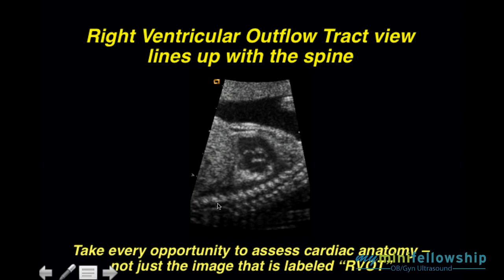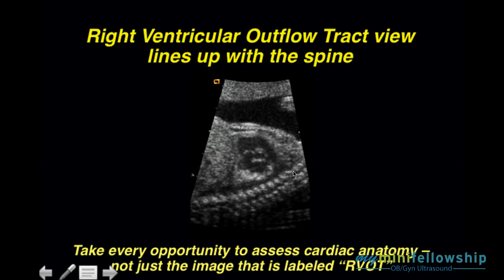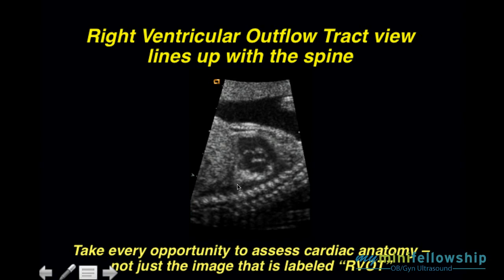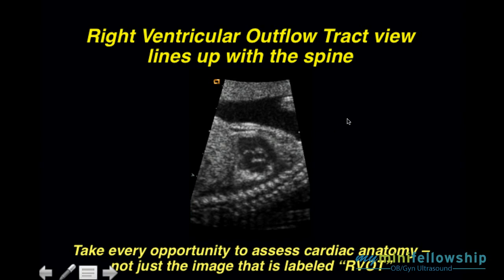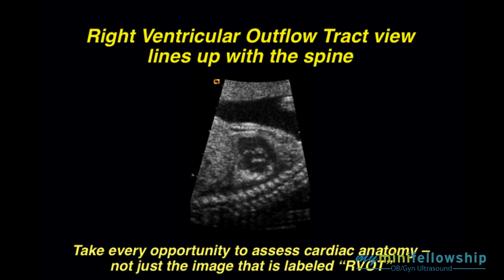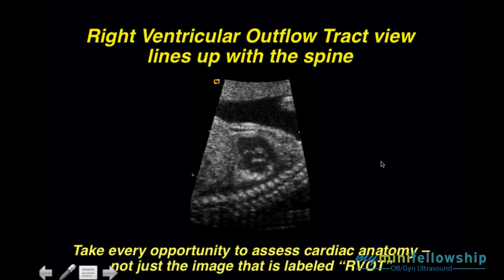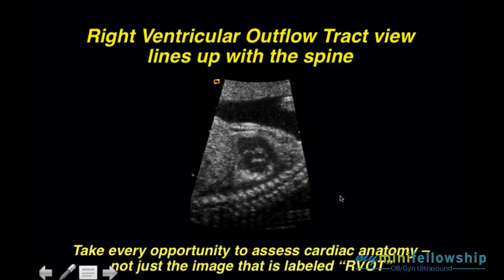Here, the sonographer is trying to get a longitudinal view of the thoracic spine. And to be perfectly honest, she did a bang-up job — that's a beautiful view of the longitudinal thoracic spine. But what else did I get? I got nearly a perfect right ventricular outflow tract view. For the radiologists and obstetricians in the audience, I cannot make this point too strongly: take every opportunity to assess cardiac anatomy. It happens on this thoracic spine view that I got a beautiful RVOT view, so I need to evaluate that to see if I think it's normal. Well, it's normal.